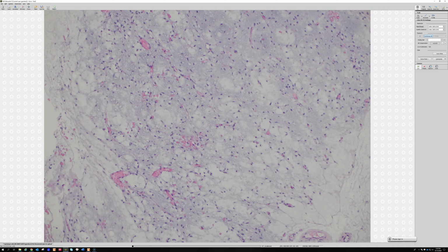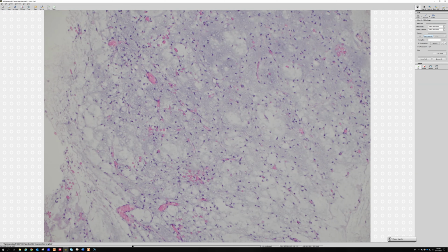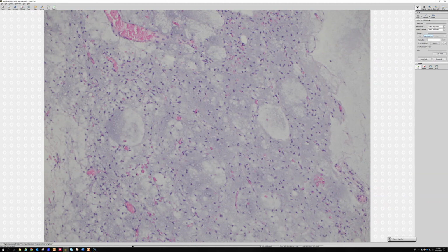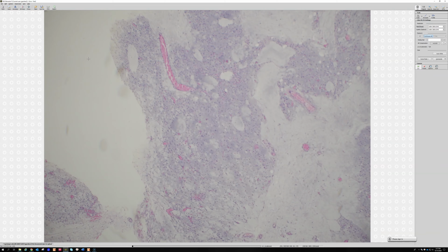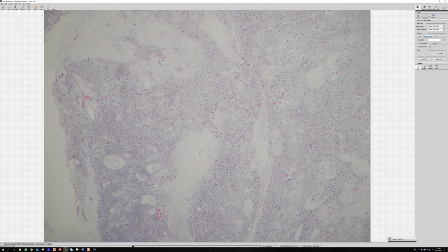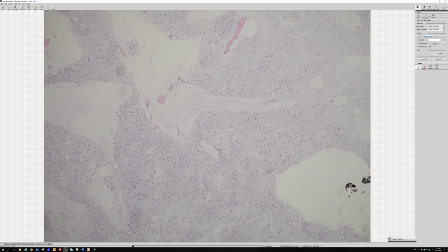And again, that's because this is a translocation tumor. So the myxoid with these very delicate branching vessels, that's the key to always start thinking about myxoid liposarcoma. The vast majority of them occur in the deep muscle of the thigh, like in the quadriceps. And they're extremely rare to see in the skin or subcutis. I've never seen a case in the skin or subcutis. It's been reported, but I've never seen one.